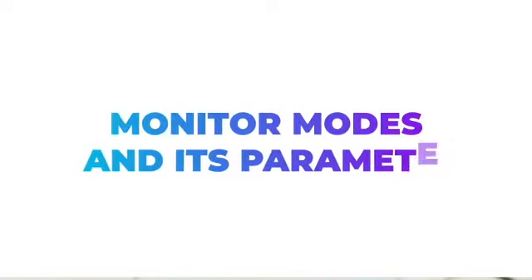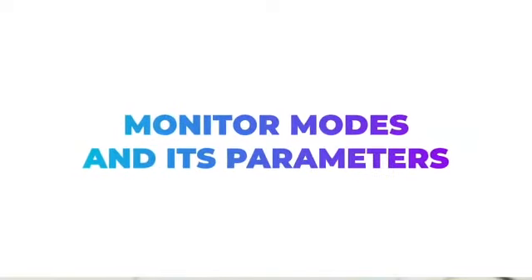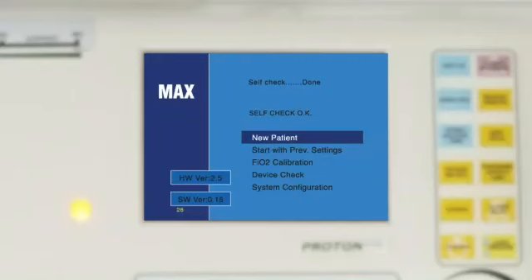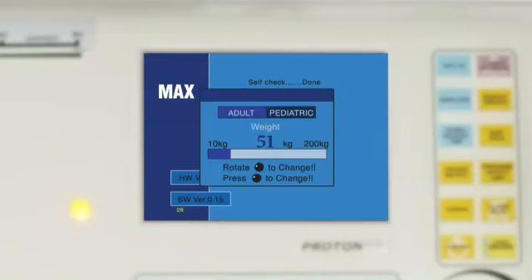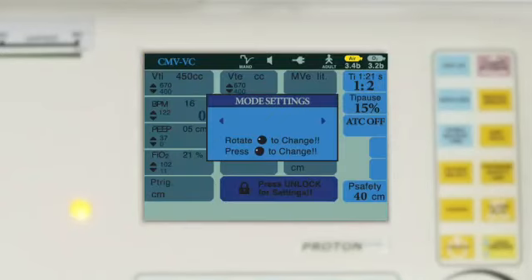Monitor modes and parameters: When new patient is selected, the system offers two options - adult or pediatric. Then weight of the patient is to be entered. Further, select the mode for invasive or non-invasive ventilation from 14 modes available.